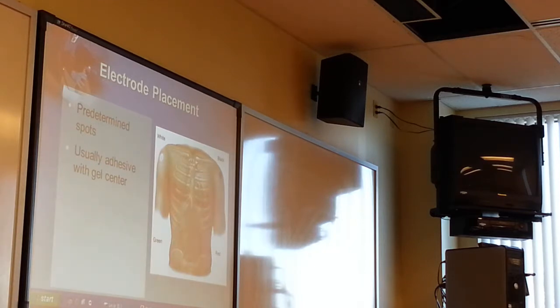There are predetermined spots for your EKG leads. You all know where they are. How many people put the 2 bottom leads right above the legs? Sometimes. Where are you supposed to put them? Where are they supposed to get their accurate read? On your legs, on your calves. The limb leads, right? And then where do you put the upper ones? Arms, shoulders. Between the shoulders. A cardiologist puts them on your belly.